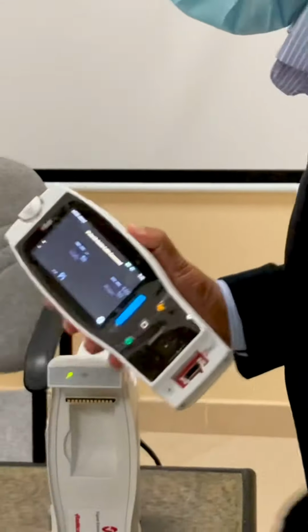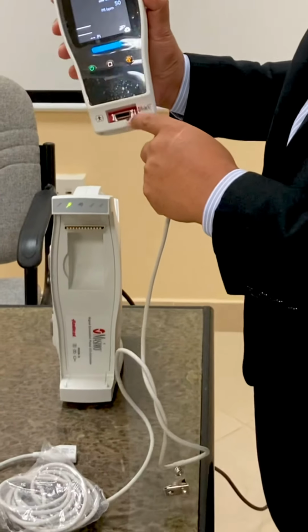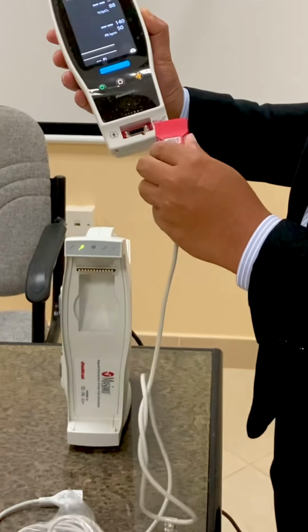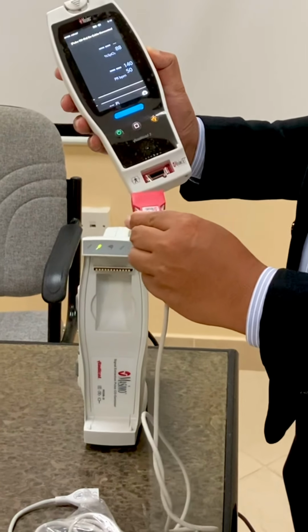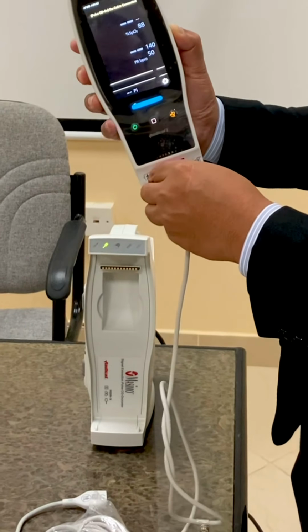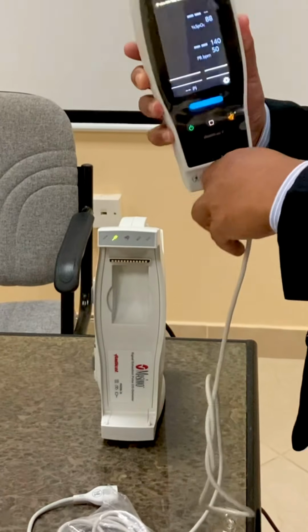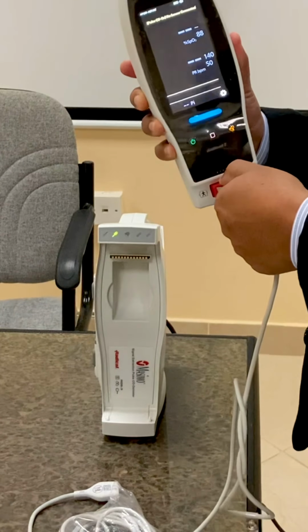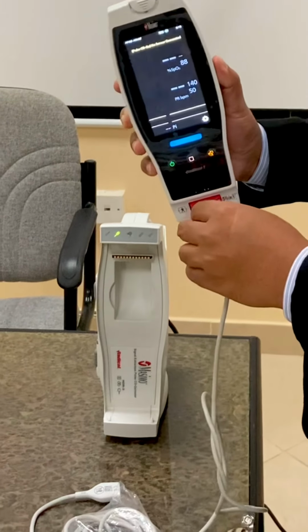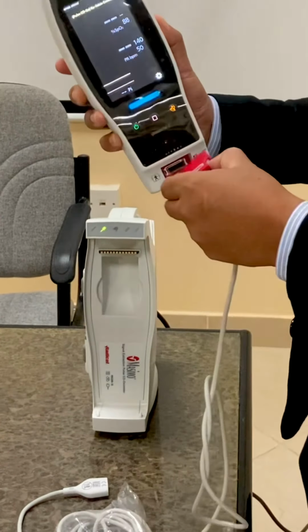The next connection will come here. You can see there is a patient cable. We are connecting the patient cables to the system first. You can see the Masimo is written over here. Just connect Masimo to that module. Make sure that it's connected well, so it will not come out. When you're taking it out, you just press on either side and then pull it out. That's it.